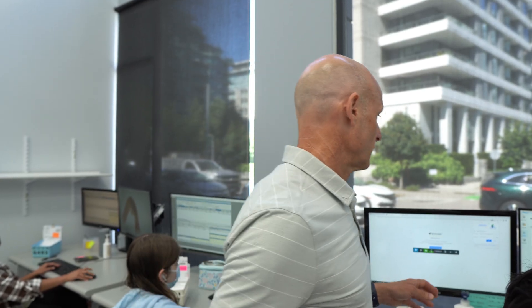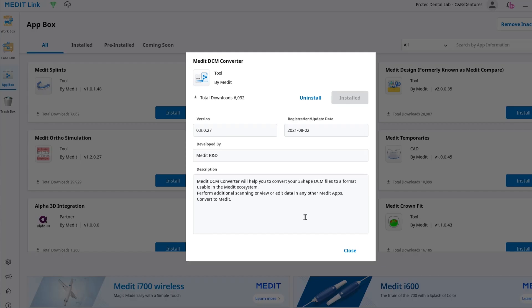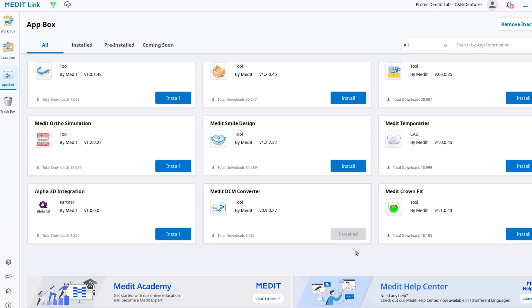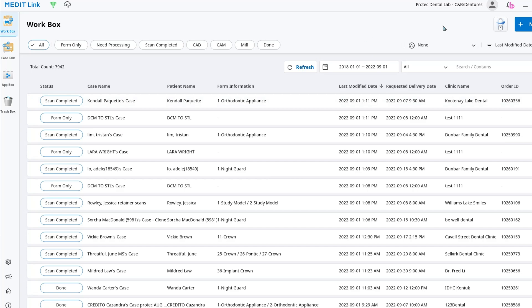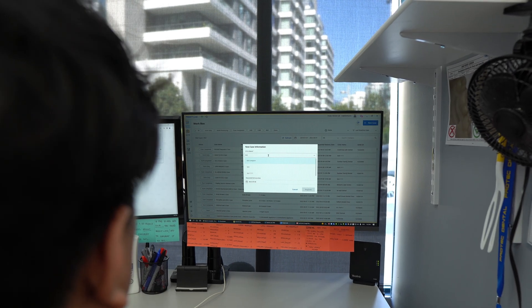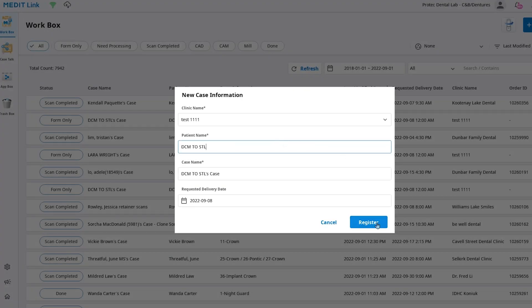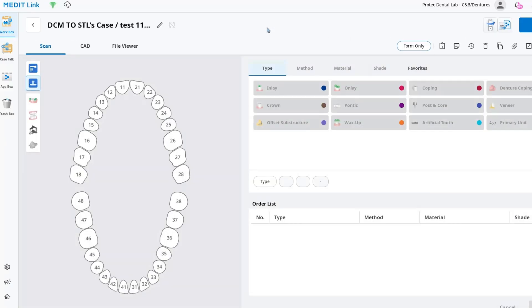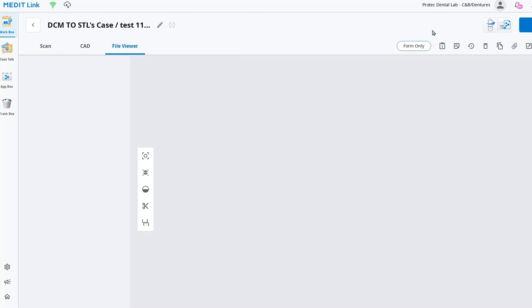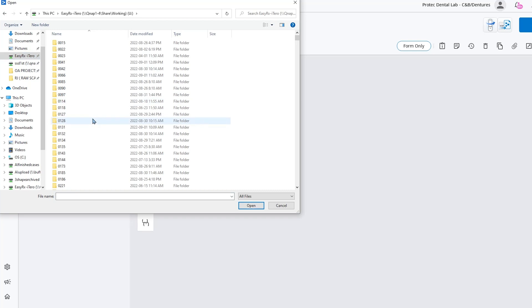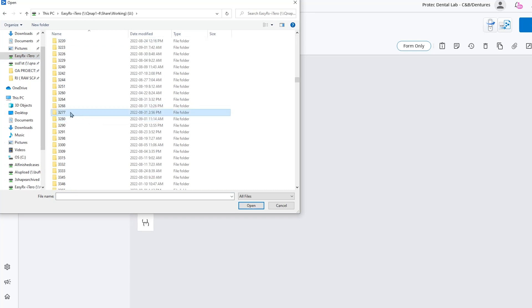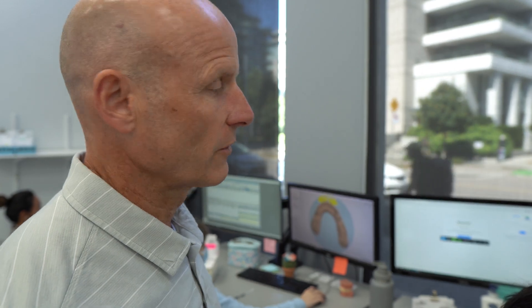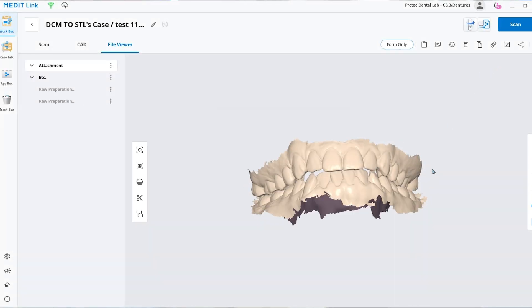As we look over Jonathan's shoulder here, he is in the Medit Link app, and in particular today we're going to look at the DCM file converter. So we start by creating a new case, and what we're doing is grabbing files that have arrived sometimes via a different intraoral scanning system like 3Shape. Those files may have arrived in a format that's not as useful for us, so we grab the DCM file from a folder where our intraoral scans are kept when they enter the laboratory. Jonathan gets the correct files and brings them into the Medit software so we can convert from DCM to STL.